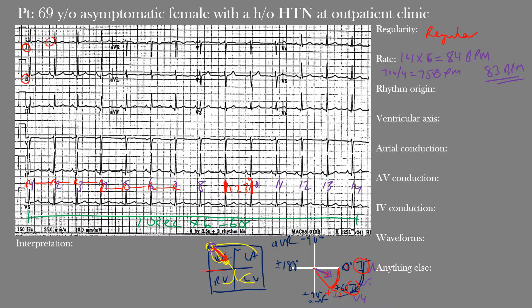Looking at the EKG: in lead I and lead II we want upright P waves — and we can see them clearly upright here. In the left lateral precordial leads V4, V5, and V6, the P waves are also upright. In aVR we see inverted P waves, as expected. The P waves have similar morphology throughout. There is a P wave before each QRS complex, and one P wave for every QRS complex. Therefore we are dealing with sinus rhythm — the origin of this rhythm is from the sinus node.